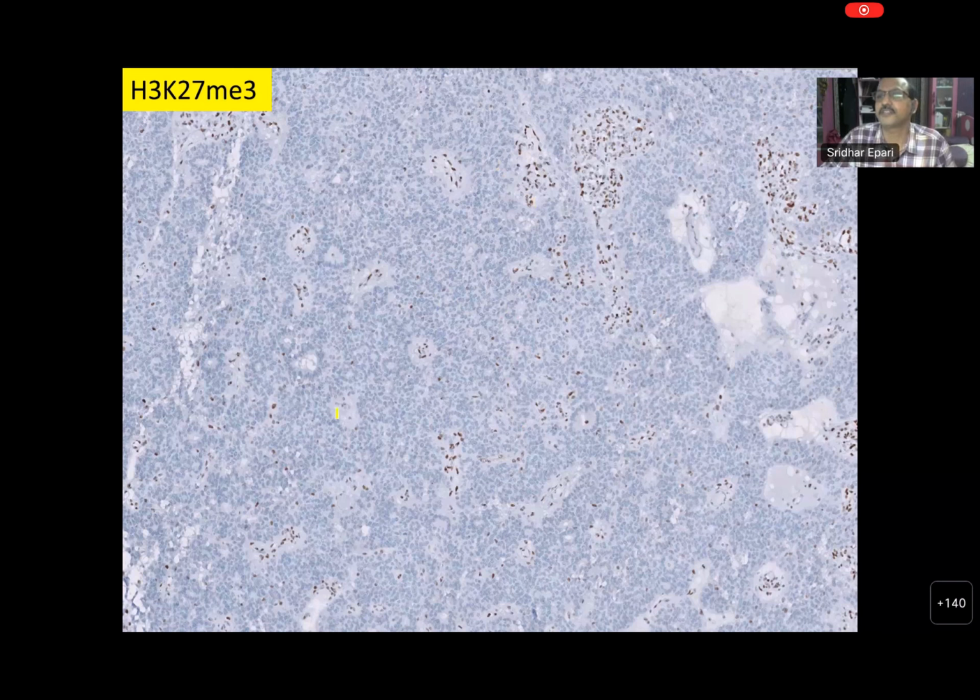First, you confirm this is an ependymoma by using Olig2, and the mimicker you ruled out, BCOR altered. Olig2 negative. So you came here. In a diffuse midline glioma, Olig2 is always positive. So Olig2 negativity tells you that it's not a diffuse glioma. You're looking at an ependymal tumor. GFAP we have not shown. GFAP is positive. So here you confirm that it's an ependymal tumor in the posterior fossa.